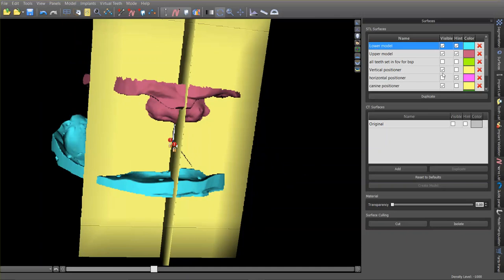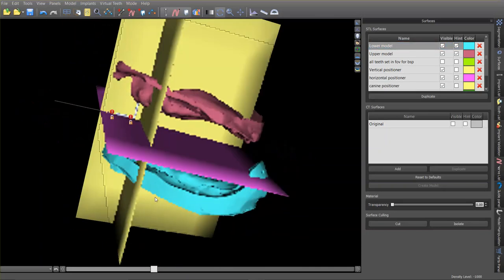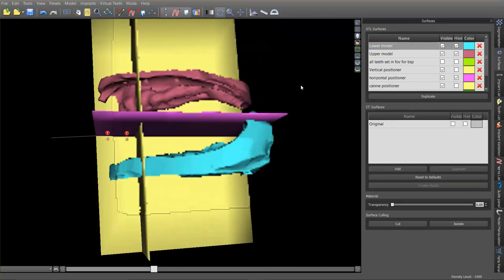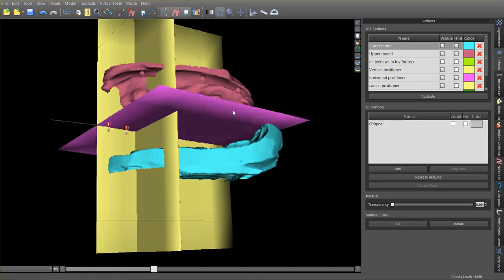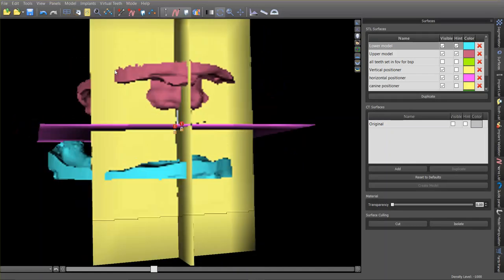Let me turn everything on so you can see it all at once. We've got all of this here, and now we just need to bring the teeth in.